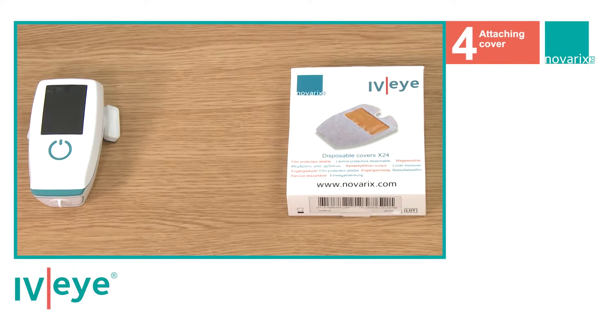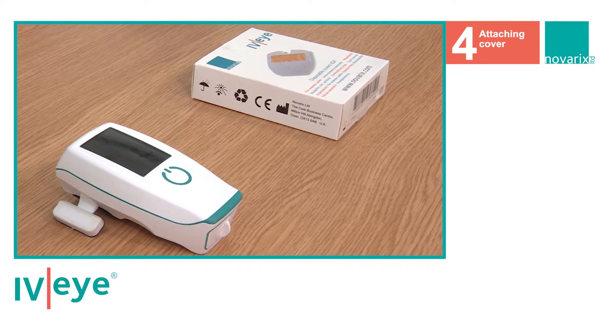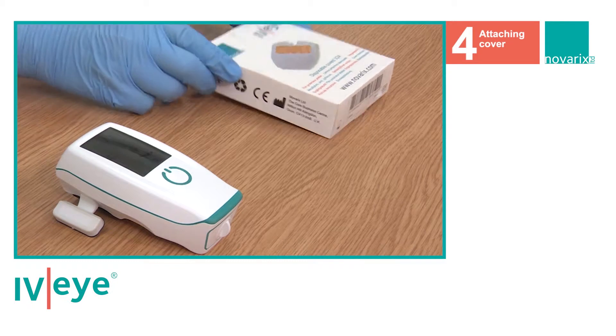Preparing the IVI for use. Attaching the disposable covers. Remove a disposable cover from its box and pack it.